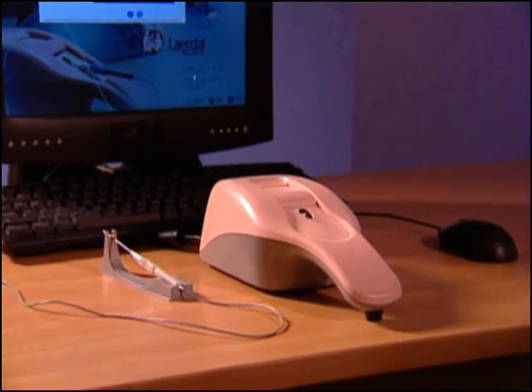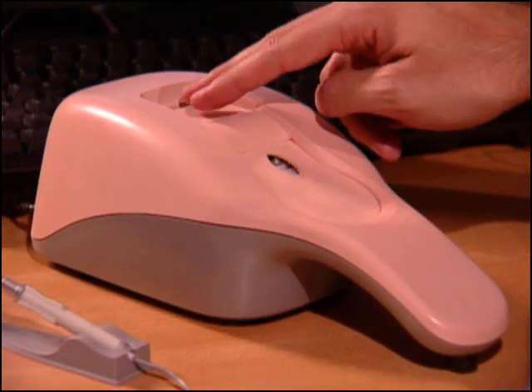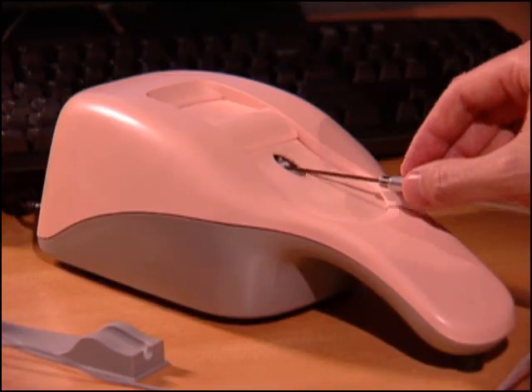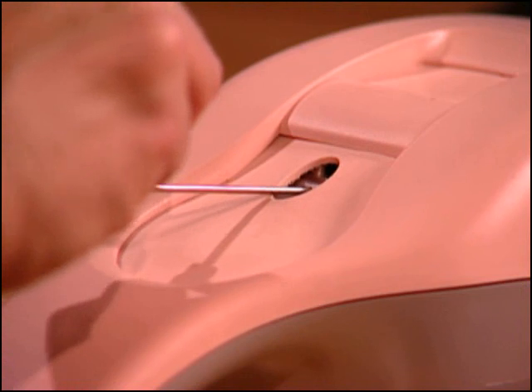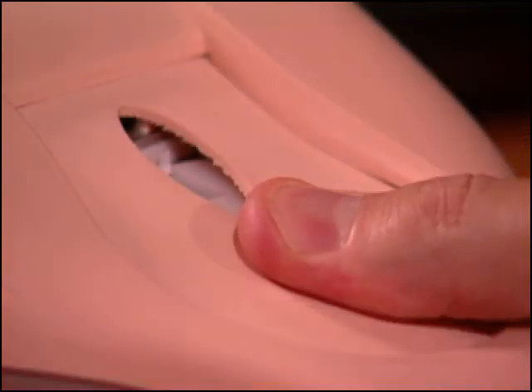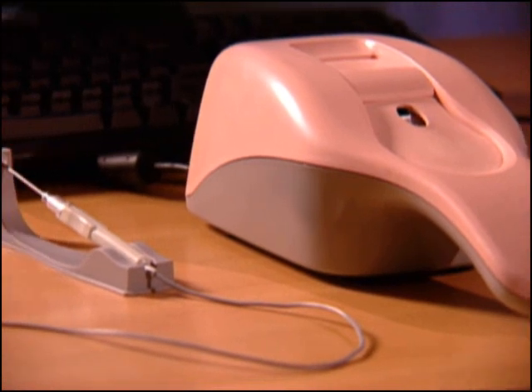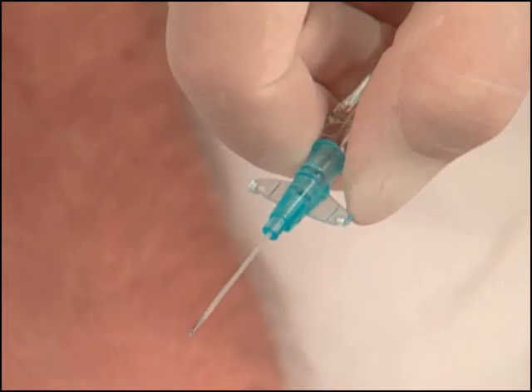Performing the procedure requires the haptic device. At the top of the haptic device is an area for palpation. This area is also used for vein occlusion. In the center of the haptic device is the needle insertion port. The needle must be inserted into this hole prior to the needle stick. At the bottom of the haptic device is the skin stretch area. Do not attempt to use a regular catheter. Use the catheter attached to the haptic device as you would a normal catheter.